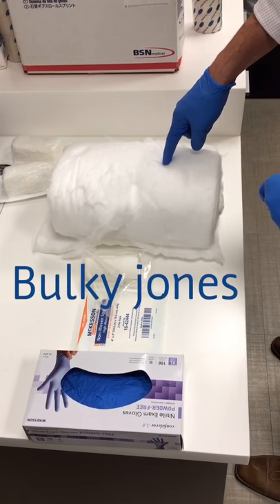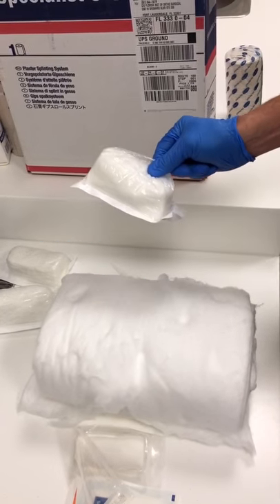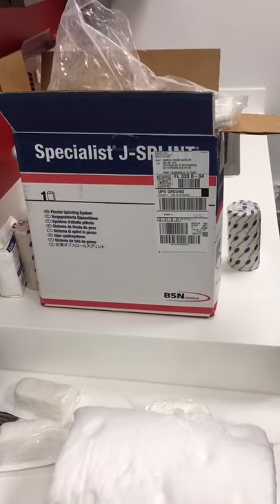This is our bulky Jones dressing, which is then followed by a 4 inch Curlex. The Curlex is what allows us to actually compress, which is a very important part of a bulky Jones dressing.